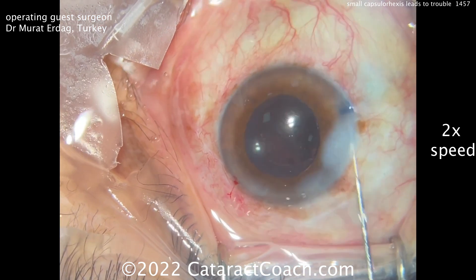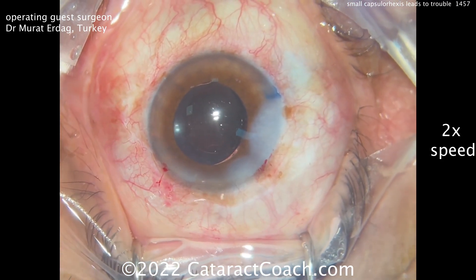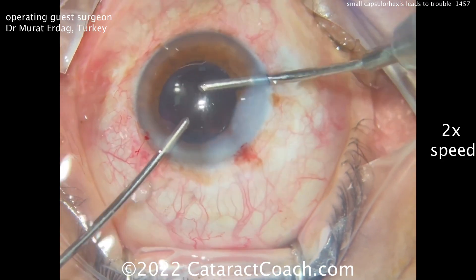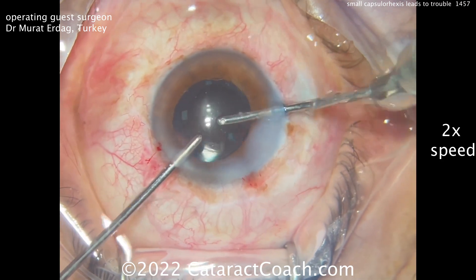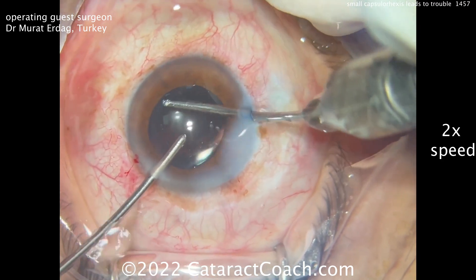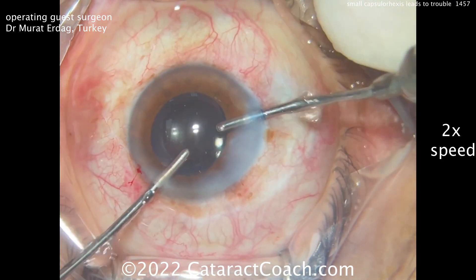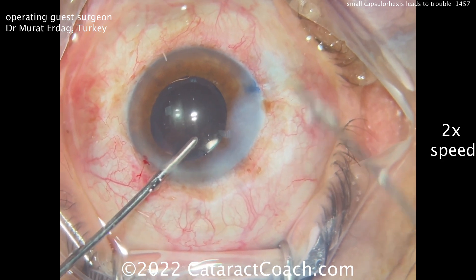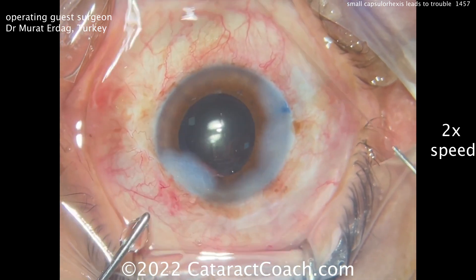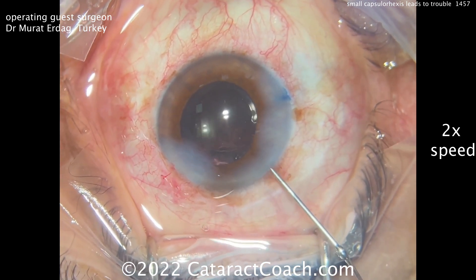Sealing the incision early is important because you don't want the AC to be unstable — instability may cause the lens to pop out of the bag or cause the capsule tear to extend toward the posterior capsule. Cleaning up and taking out the remaining viscoelastic: be gentle, don't rotate the lens, and don't worry about polishing the capsule — that's the least of your concerns. The goal is just to get out safely. Maintaining infusion in the AC with the left hand while the right seals the incision is beautifully done — a good save and a very nice outcome. Think twice before making a small or baby-sized capsule Rhexis; it could make your life more difficult and pose real challenges.